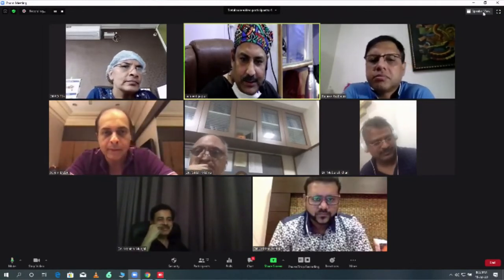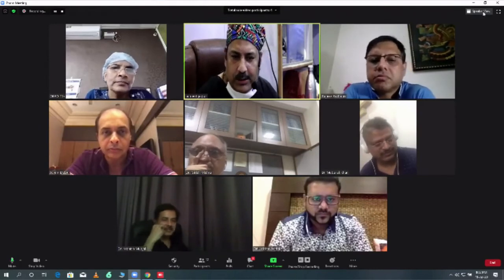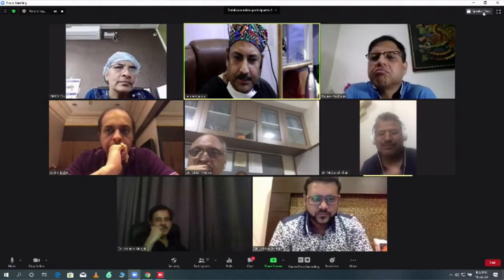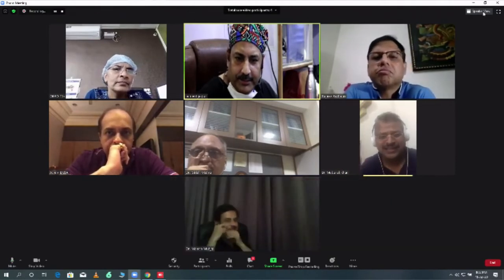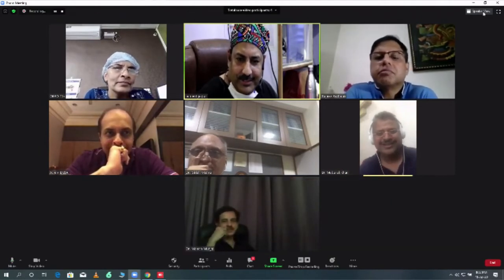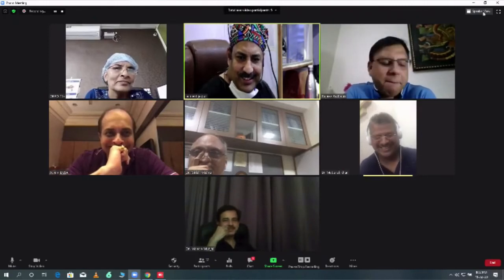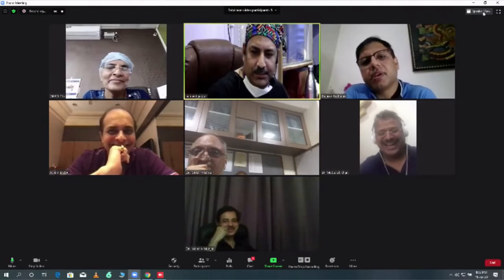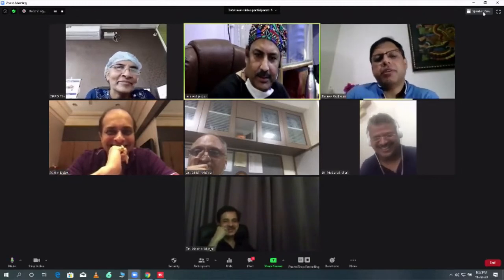That's why this piston, anybody can use it simply. You don't have to apply your brain. Just push it. Always remember, with this anybody can dance now. There was a movie called Naam. Oh, it's not that easy. No, this piston is really, that's called ABCD. It really makes life easy. Anybody can dance.